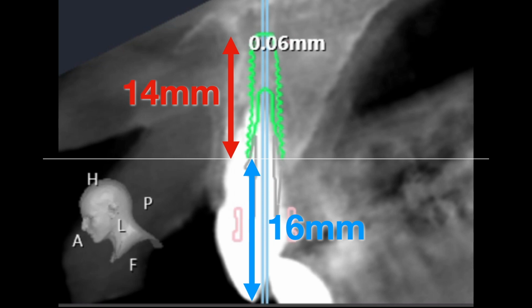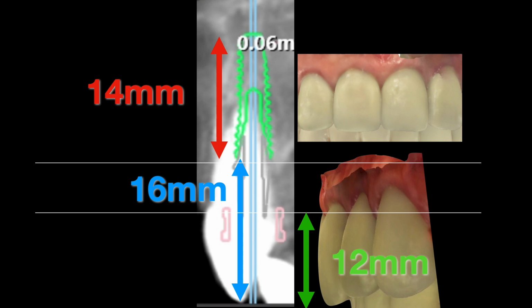Why is that important? It's because when we do the actual implant planning, this is the same case, I want to figure out what size implant to put in where, what trajectory, and occlusion and the opposing teeth have a lot to do with it. So here I have managed to put all the data together and figured out the exact proposed position, dimensions, angulations. All of these were pre-worked up. But the important thing is I need to know where the proposed tooth will be, and therefore the implant position works with that in mind.